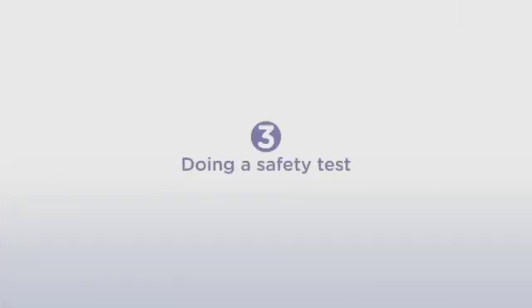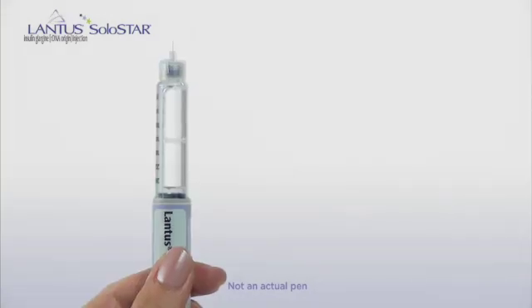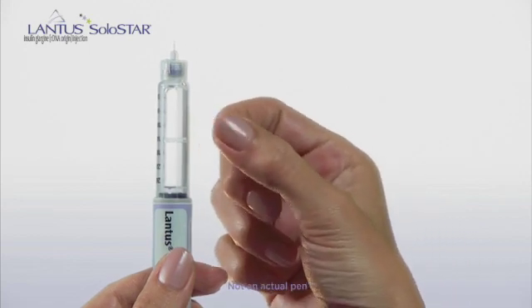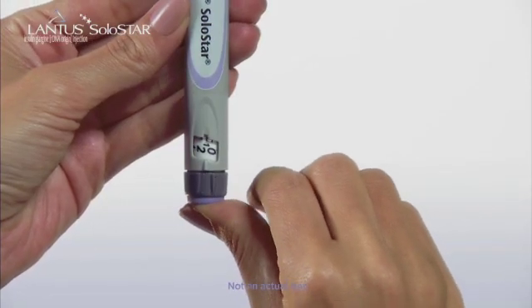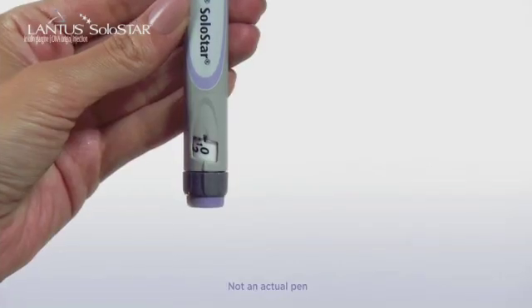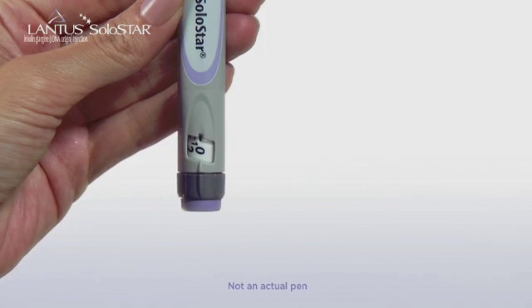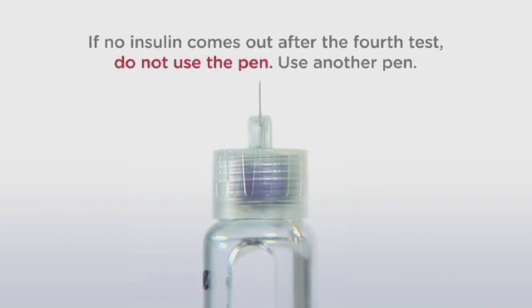Now let's move on to Step 3, Doing a Safety Test. First, dial a test dose of two units. Now, holding the pen with the needle pointing up, gently tap the reservoir so the air bubbles rise up to the needle. Then, press the injection button all the way in, and check to see that insulin comes out of the needle. The dial will automatically go back to zero after you perform the test. If no insulin comes out, repeat the test two more times. If that doesn't work, then use a new needle. If no insulin comes out after you've changed the needle, do not use the pen. Use another pen.